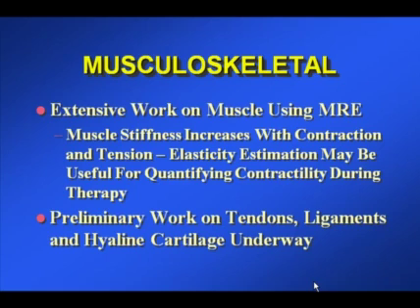This is always a big issue, especially in the physical therapy community, where they want to be sure that the patient receives feedback that the muscles they're hoping to contract during the therapeutic sessions are actually contracting. Preliminary work on tendons, ligaments, and hyaline cartilage showing stiffness changes in relation to pathology are underway.